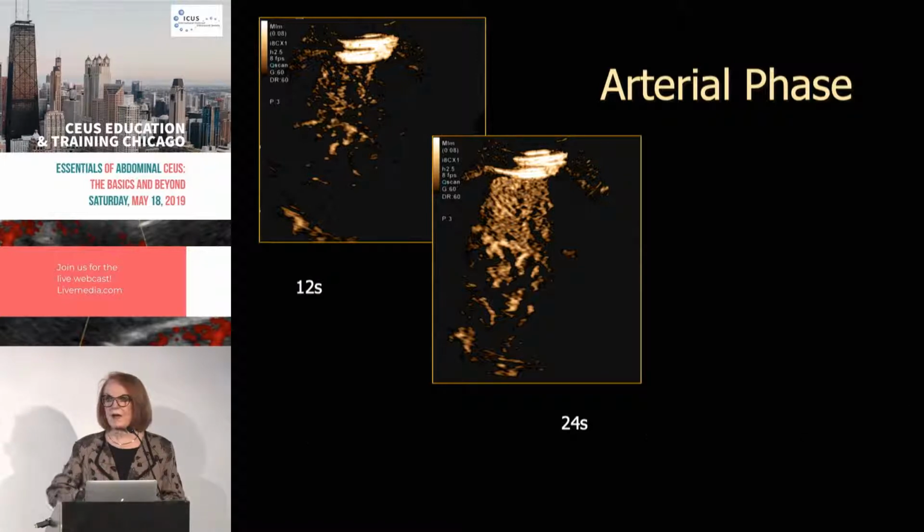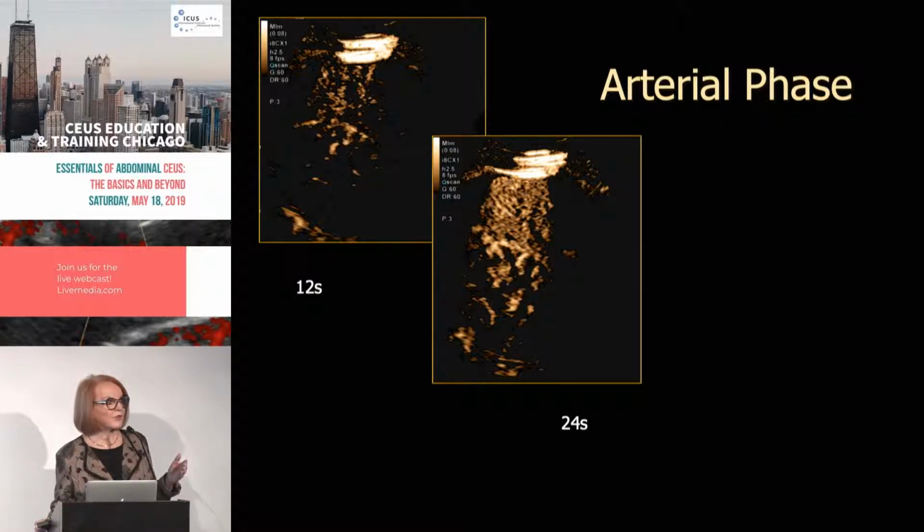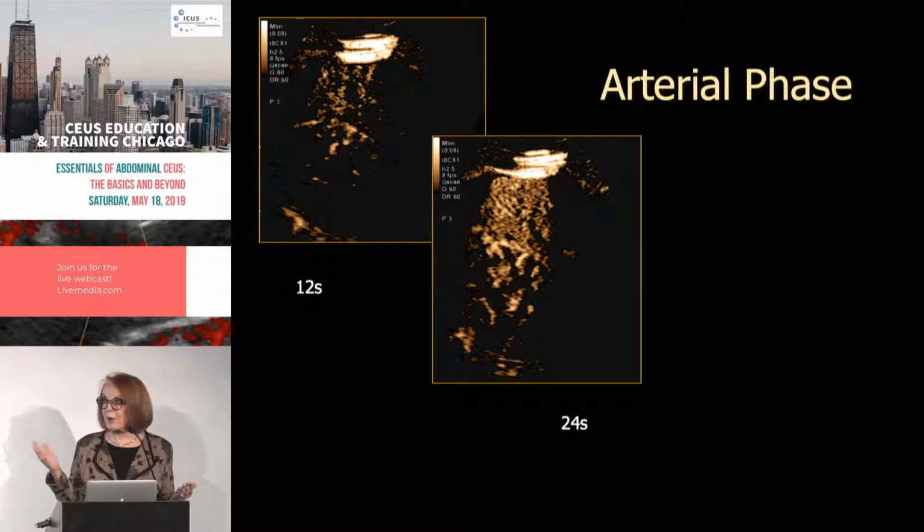Now we have enough equipment and we do so many scans that when we get a new machine in, I've lost my motivation to become totally proficient on every machine. So now my techs present to me what they're going to do. Depending on how many scans are going on, sometimes we're doing 2 or 3 contrasts even at the same time, not just scans. And so I don't always go in. They know when to come to get me. They know exactly how to do it.